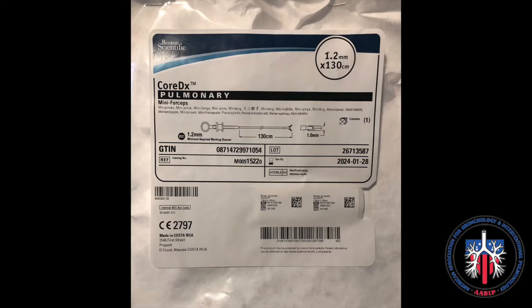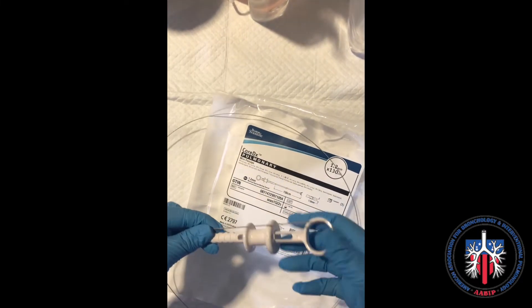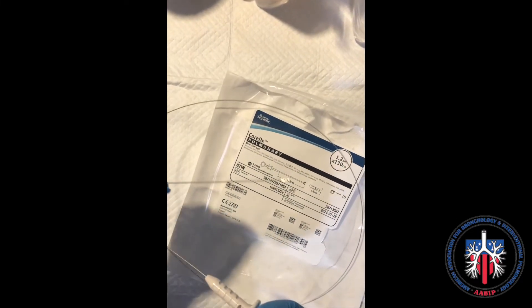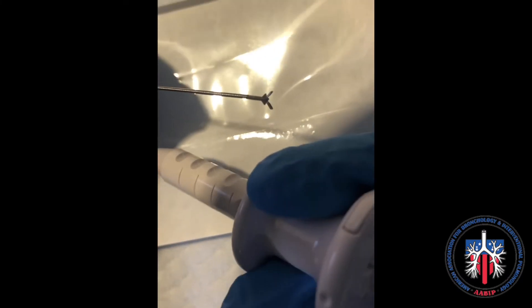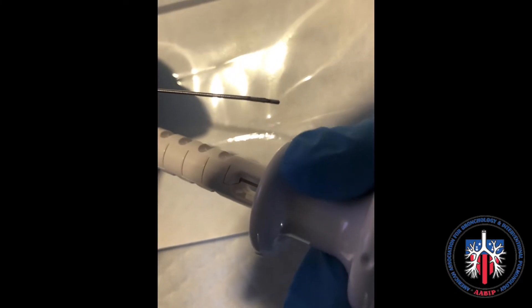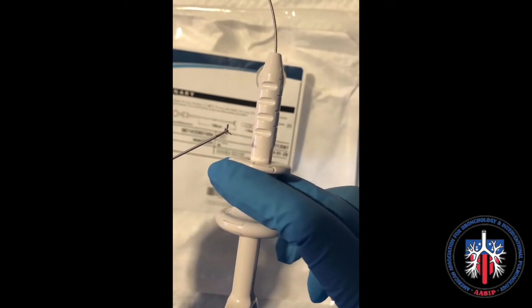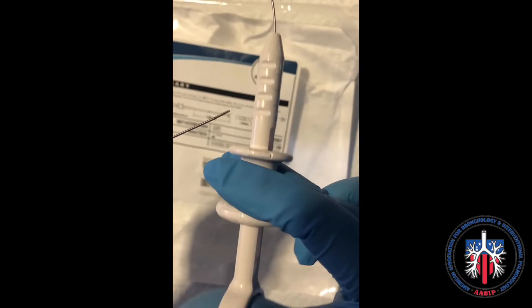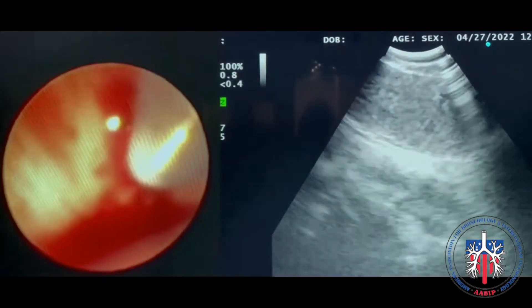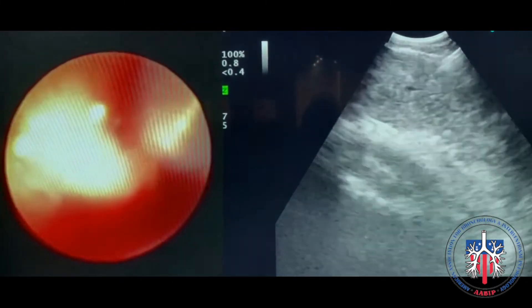CoreDX is an intranodal biopsy forceps. It comes in one size of 1.2 mm. A mucosal entry site is created using an eBus needle to obtain an intranodal biopsy.